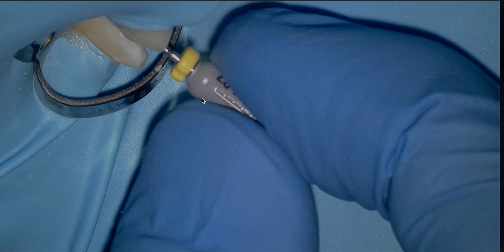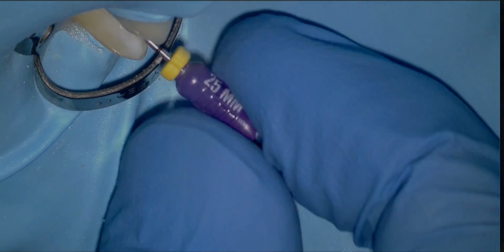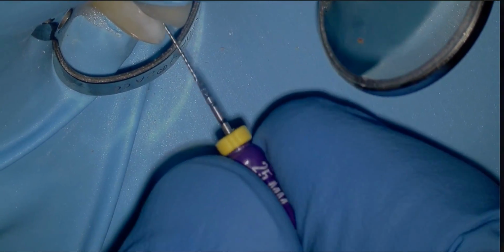So that's a smooth glide path right there. You saw what I was able to do right there. This is what I would consider a beautiful loosey-goosey glide path. File goes up and down, nice and smooth. It's not binding whatsoever. So I'm going to take my 10 file, do the same thing. Again, that is a glide path right there. Smooth glide path. I'm going to make sure that there's no little bumps or anything in the way. I'm gone out the end a millimeter or two. Actually, it's half a millimeter.